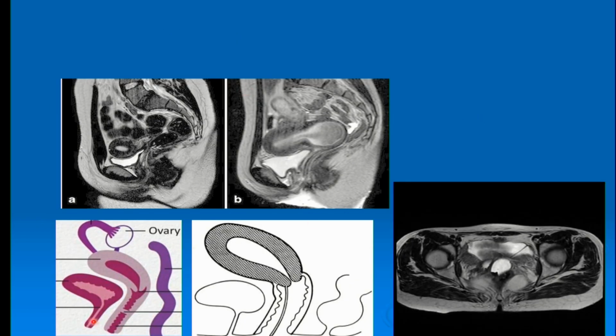So this is a transverse septum, this is a longitudinal septum, diagrammatically shown on MR, and here you can see the collection in the lower cervix, sometimes into the upper fornices as well. I will show it in the next case.